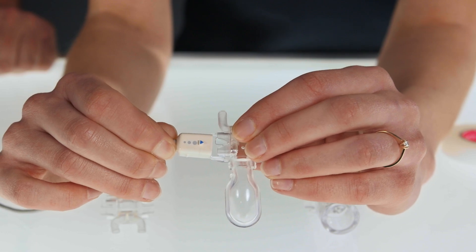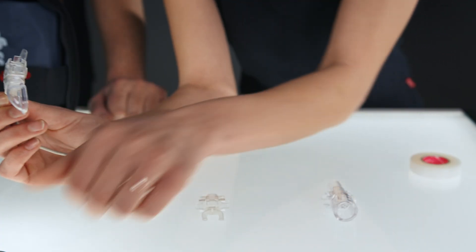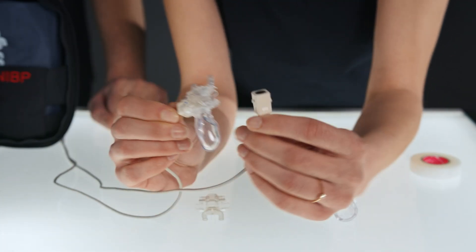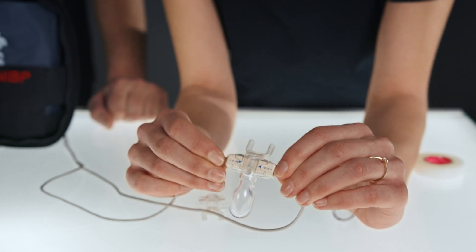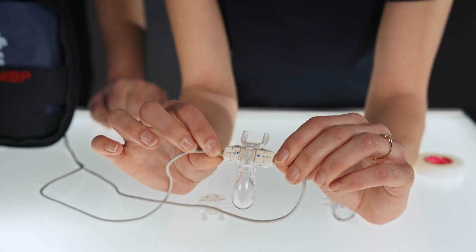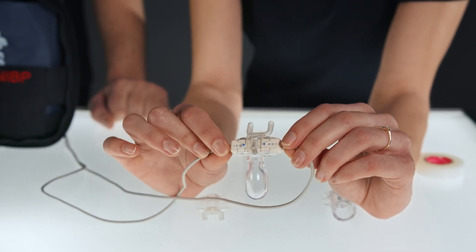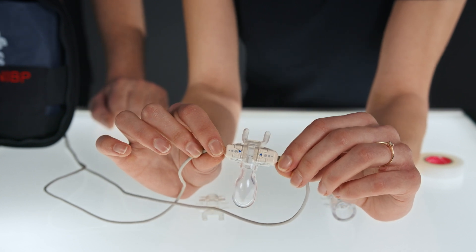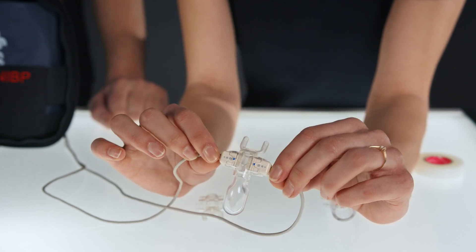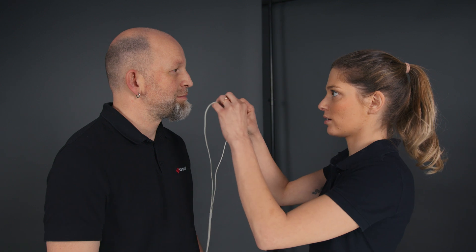Now when we push this together, you can hear how it clicks into place. We will do the same thing on the other side. Now we are prepared for measurement. Ben, can I show you how I would apply this to a patient? Yes, definitely.